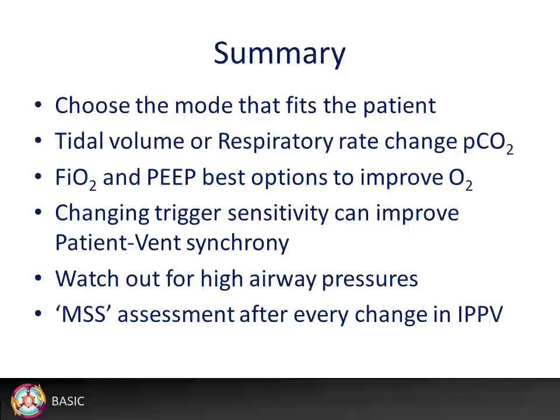To summarize, choose the mode that fits the patient, but take into account your familiarity with the different modes. Tidal volume or respiratory rate change the PaCO2. FiO2 and PEEP are the best options to improve the PaO2. Changing trigger sensitivity can improve patient ventilator synchrony.